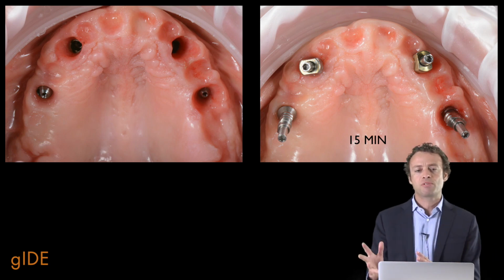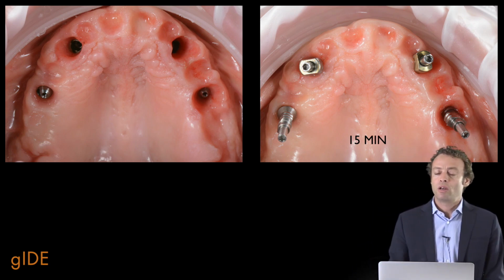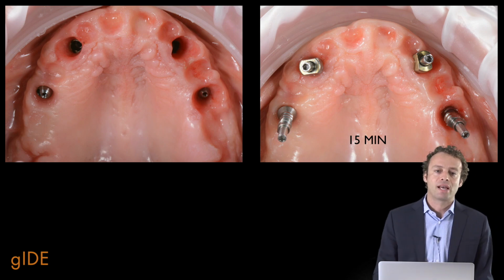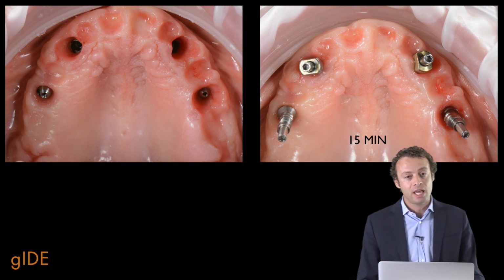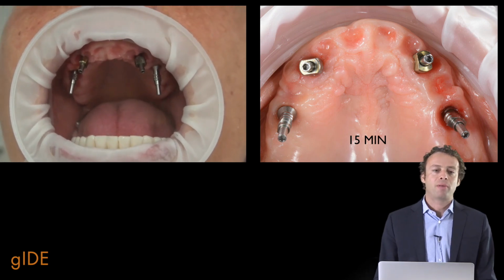So of course, the same story. If I take this impression, the dental technician will not have a good model from which he can realize a good framework and a good rehabilitation. So first step, impression with the plaster.